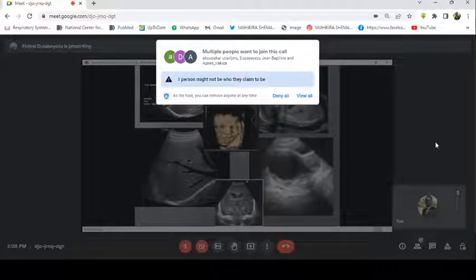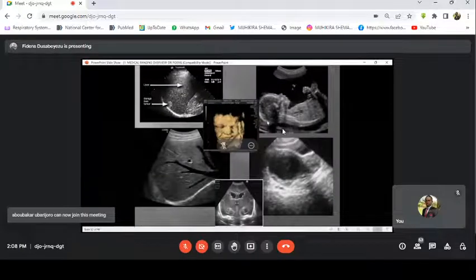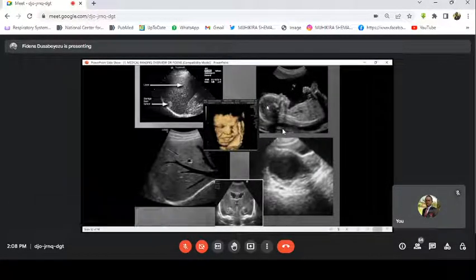Going to this one up on the right side, you can see the fetus that is in the uterus, in the abdomen, where you can see the head very well. The skull is white because it is reflecting much sound waves. The brain is somewhat dark because it doesn't reflect much. Some waves continue going, and you can see the nose, the mouth, the spine behind, the neck, even the heart. Can you see the heart here?